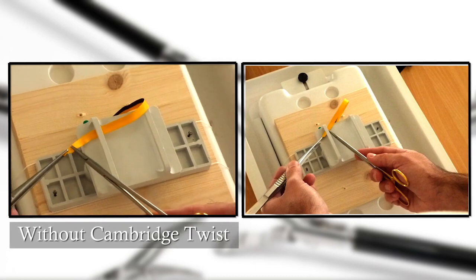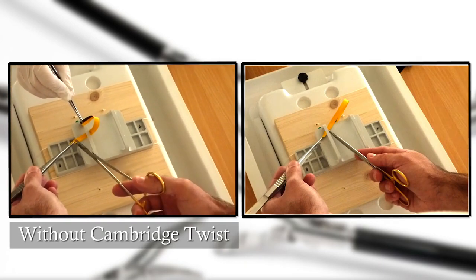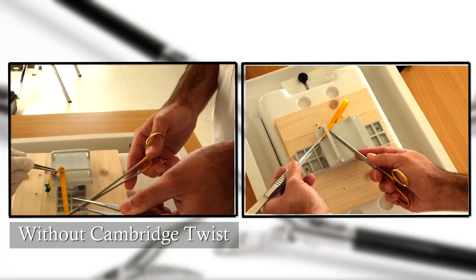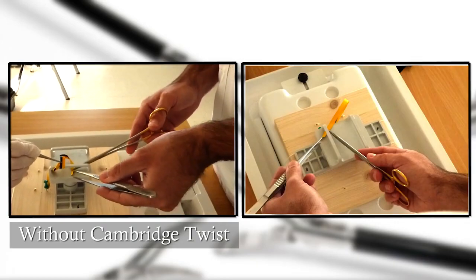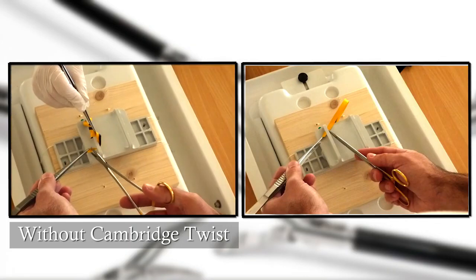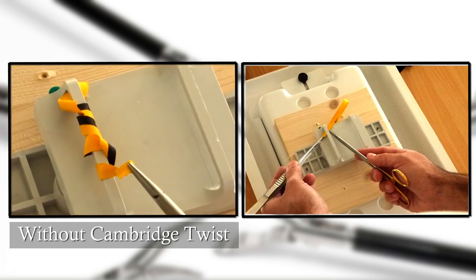Here we use a double-colored ribbon that demonstrates well the twists that form on the thread when the surgeon does not apply the twist. On the left side of the screen, the ribbon is being sutured in a classic fashion without turning the needle holder at every pass. The result, exaggerated by the ribbon, shows twisting of the suture.